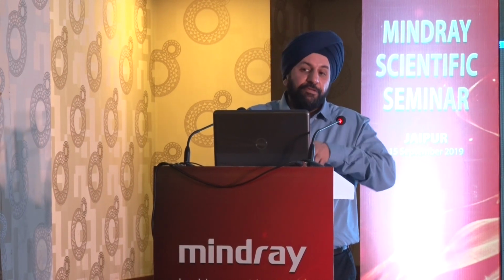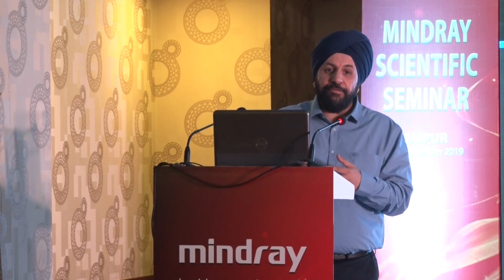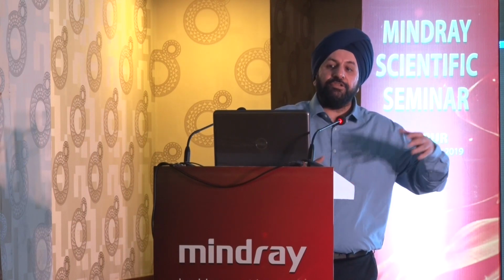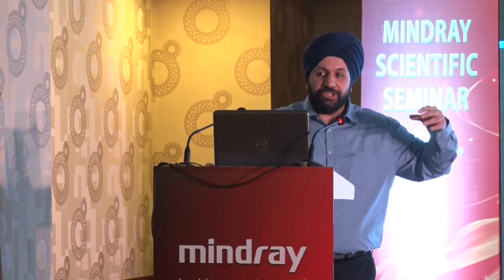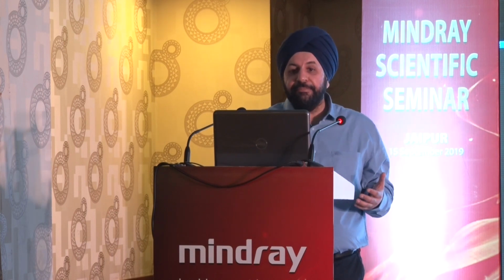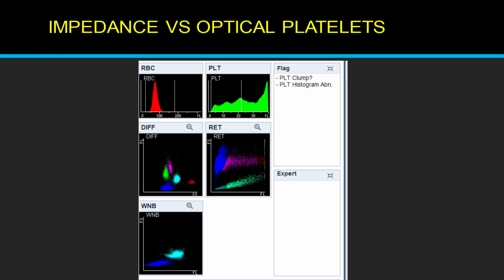The ethnicity is tricky, and apart from Harris platelet syndrome, we also have Mediterranean platelet syndrome, especially in people coming from erstwhile Pakistan, the more northwestern frontier province like Peshawar or Multan. Those people also have these hereditary macrothrombocytes, and they could also have high IPF like in Harris platelet syndrome. So if you look at the platelet histogram, it is all over the place. It is telling you a story that smear review must be done.